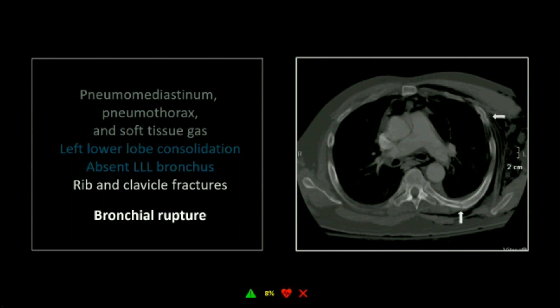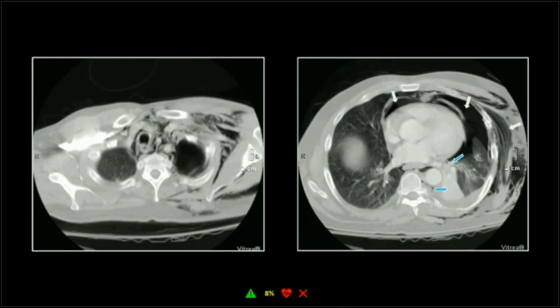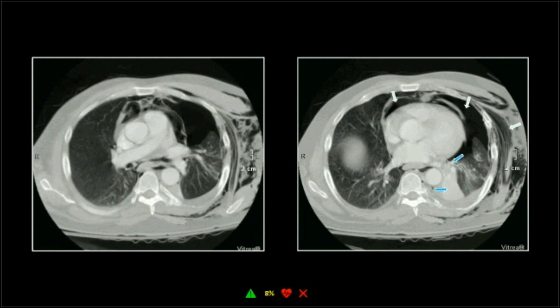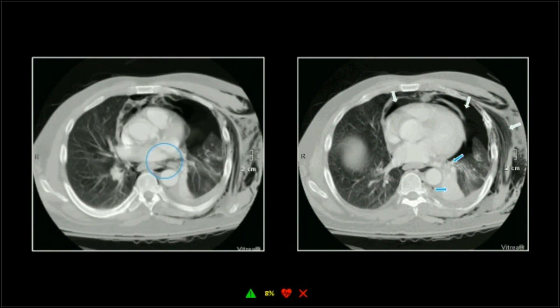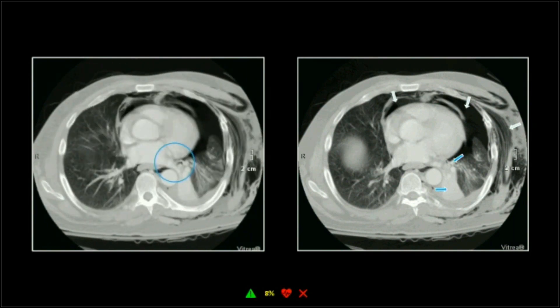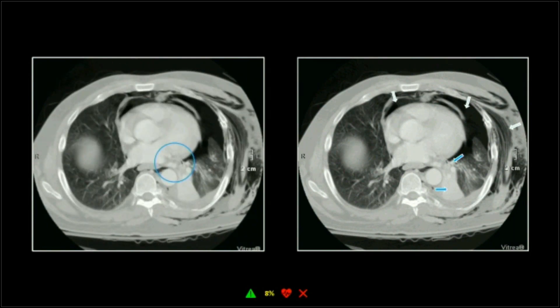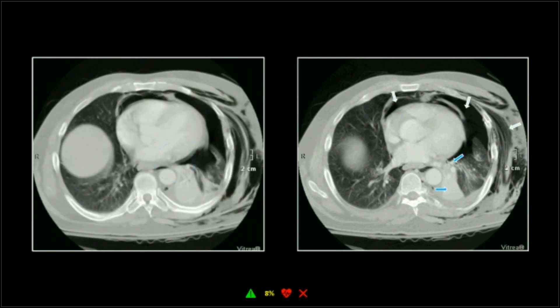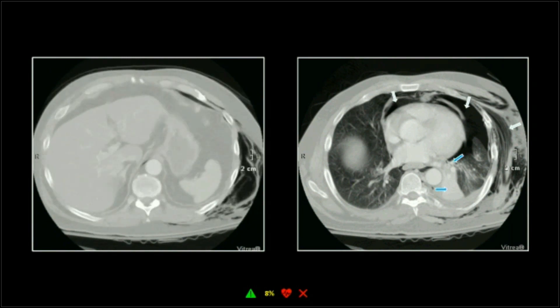When I see these kind of bracketing rib fractures, I get concerned about all of those sorts of injuries and go looking for them. You can actually follow that left lower lobe bronchus, and you just kind of lose it before it ever enters that atelectatic left lower lobe.